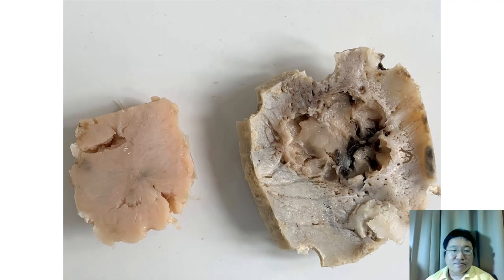And here, the previous tumors are intraaxial tumors, they originate in the brain. But now, this one is a different one. This one is an extraaxial tumor. So this one is also from the museum at my department.